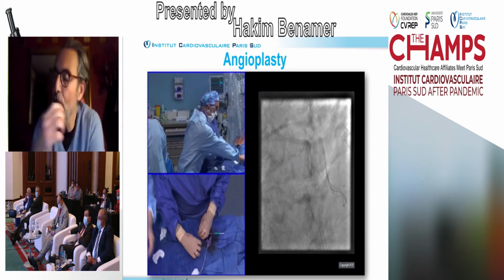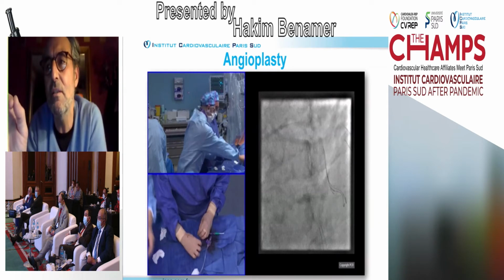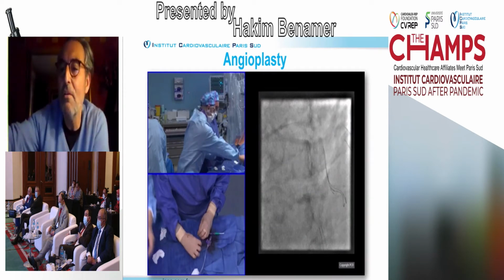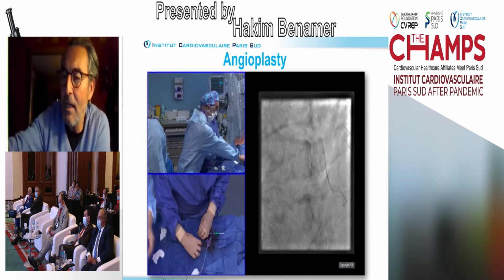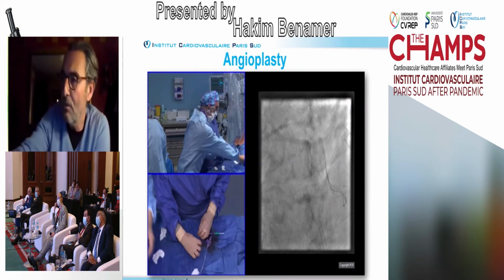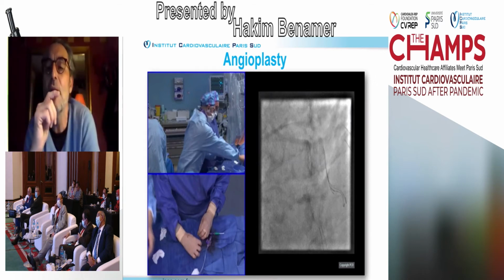So to reach the distal strut, you have to go distal to the bifurcation and come back very slowly, and then fall in when you did a very good POT. When you are coming back with your wire, you can really fall into the branch, crossing the strut.